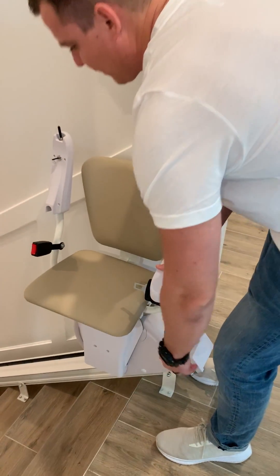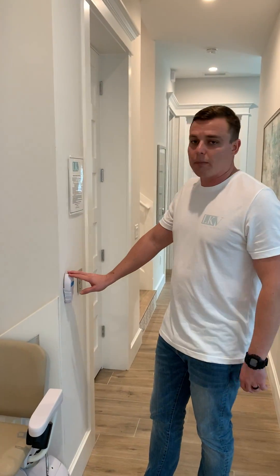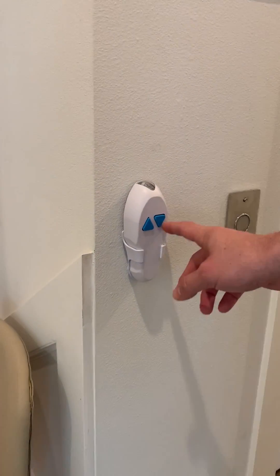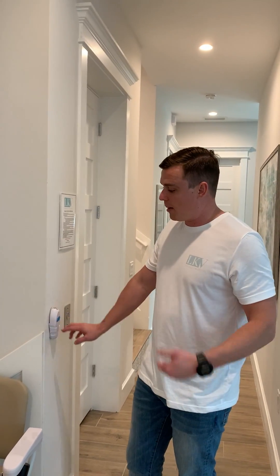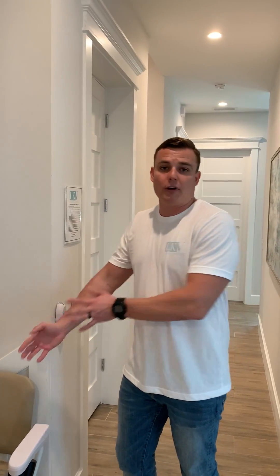You can control these stair chairs in one of two ways, either using the remote that's fixed at the top and the bottom of each stair landing. You have the down arrow, which brings the chair down, or the up arrow, which brings the chair up. These can control the stair chair at any point in time. So if you start and you get a foot down or a foot up and you need to start over, you can easily just push the other button and it will retract the stair chair to its original spot.